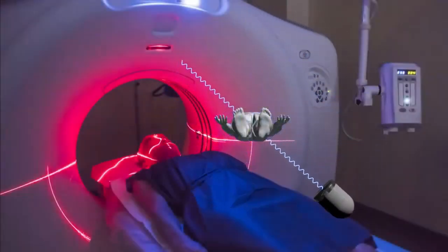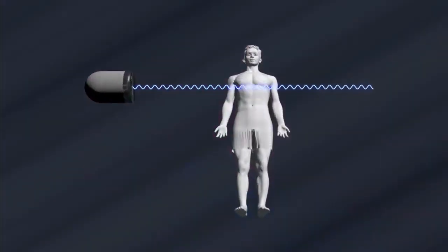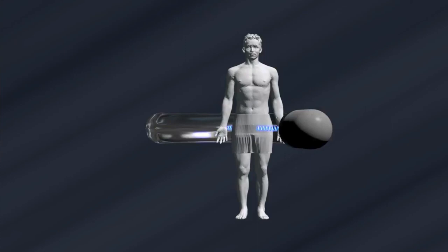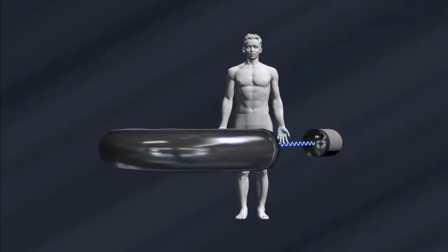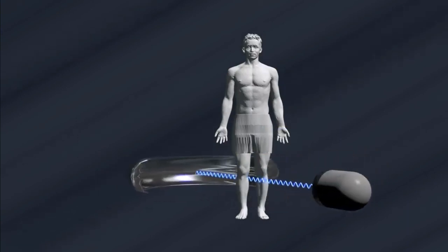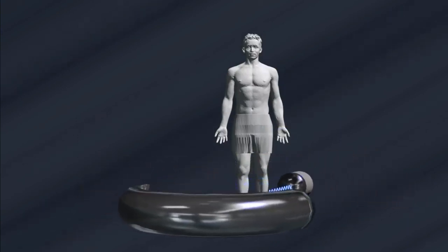For example, a multi-slice would make it easier to examine unruly children or weak elderly patients that can't lie still for too long. While multi-slice CT machines have become the industry norm, the single-slice machines are still useful components and should continue to be around for quite some time.